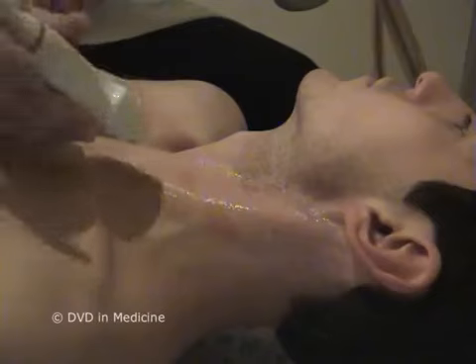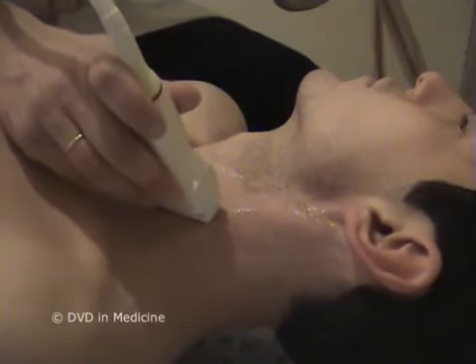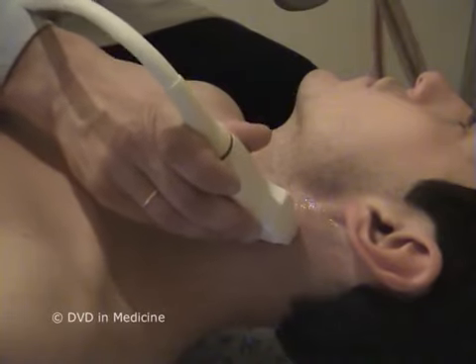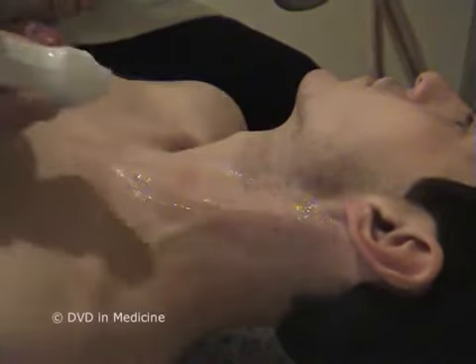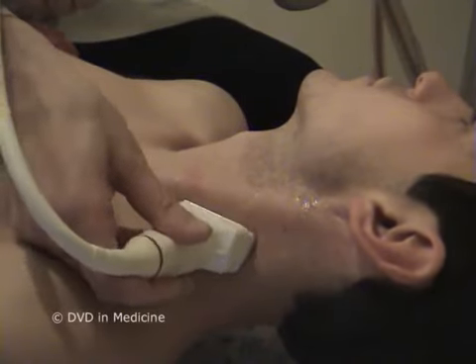With the lateral approach, the position of the transducer is directly on the sternocleidomastoid muscle. With the posterior approach, the position of the transducer is behind the sternocleidomastoid muscle.